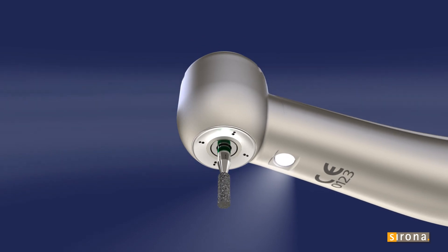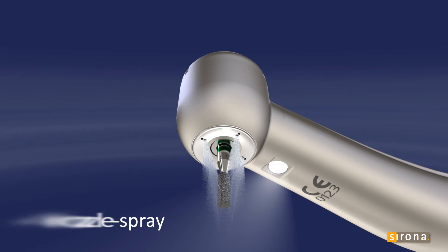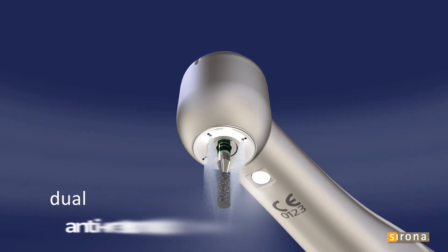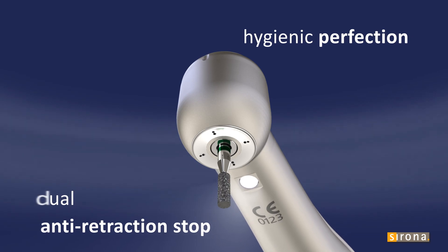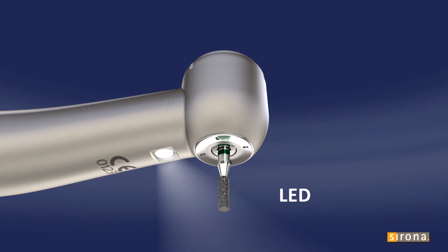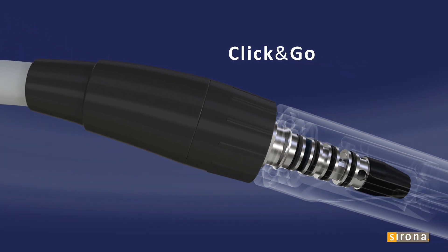Thanks to the high quality rotor and the new four nozzle spray, the Sirona T1 turbine is amazingly quiet, so you can work in relaxed comfort. The dual anti-retraction stop makes preparation hygienic and flawless. The LED provides brilliant illumination of the preparation site. The click-and-go interface lets you connect Sirona handpieces without any additional cost.